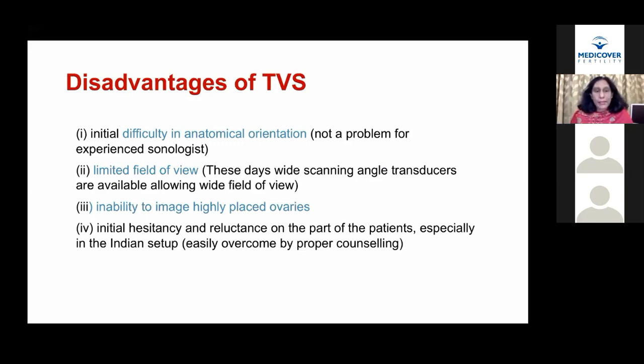It also has a limited field of view, but nowadays we also have a wide scanning angle transducer. Sometimes the ovaries are misplaced, and it may be difficult to image the displaced ovaries. Patients may find it a little reluctant initially because of the probe, but if you counsel them properly and make them understand that this is going to give you a better image, most of the patients cooperate.